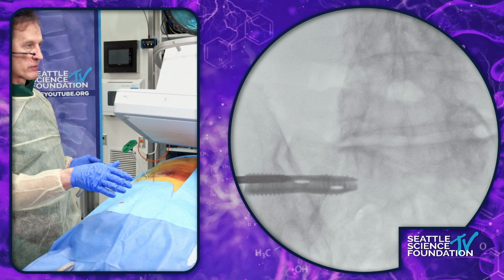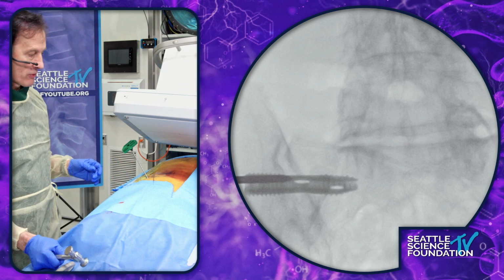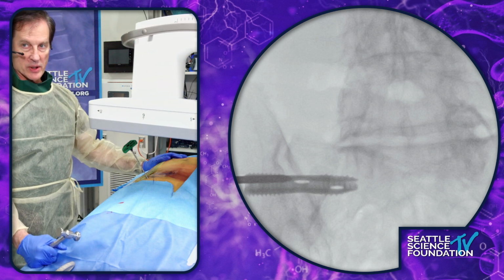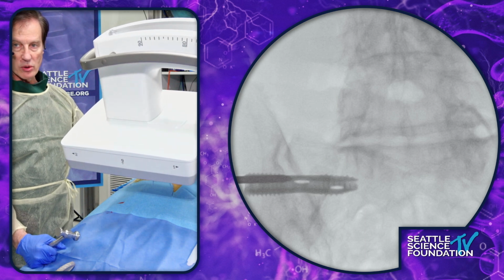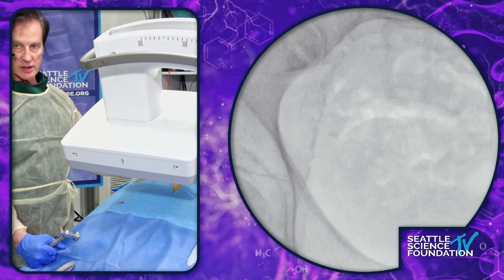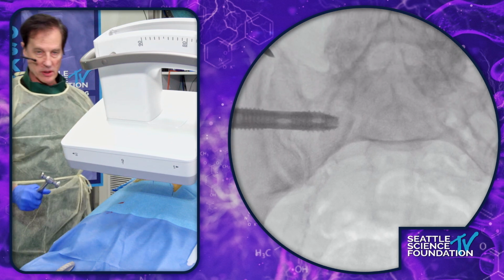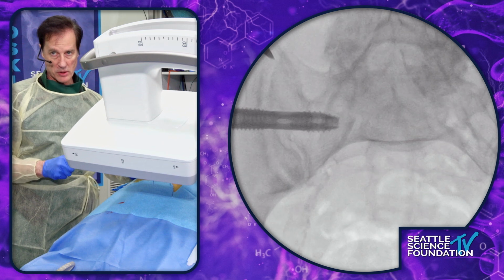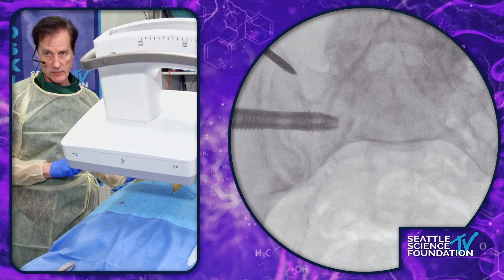So you start off in the outlet view, go to the inlet view, and we'll make sure we have our orientation. So this is roughly aligned with the end plate of S1, the superior end plate of S1. And we'll get our medial lateral throw here, our angulation for our medial lateral throw, which looks pretty darn good. I'm going to angle it about like that.